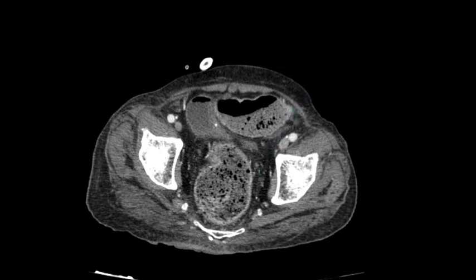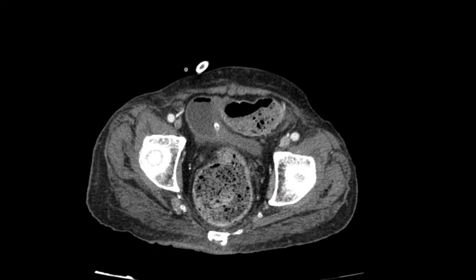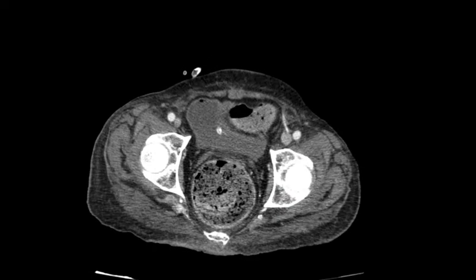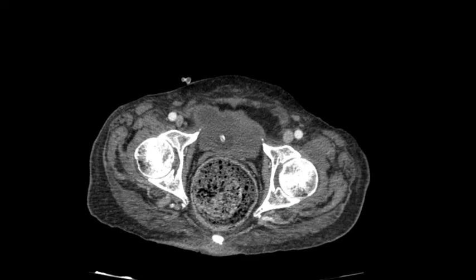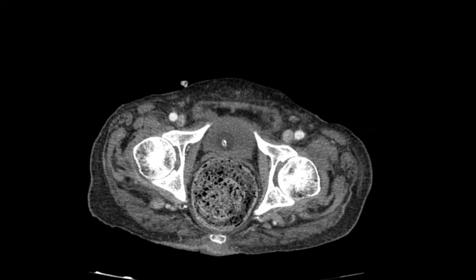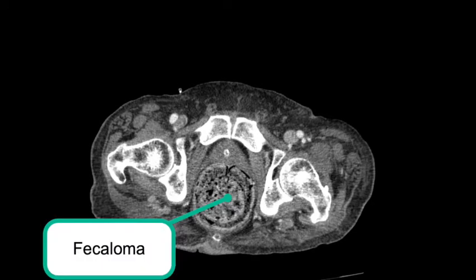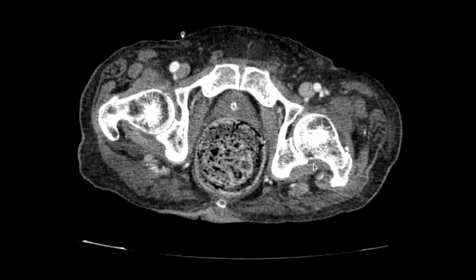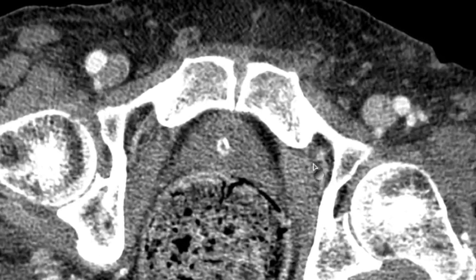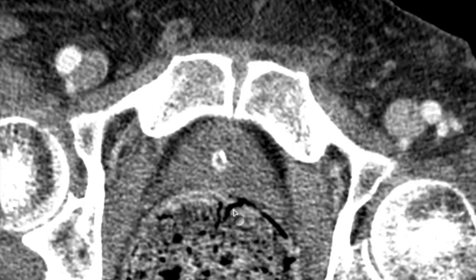There is also a ball of hyperdense fecal material within the rectum, which is called a fecaloma. As I zoom in, you can also see that there is a penetrating ulcer in the anterior rectal wall and you can see gas strands in the bowel wall.